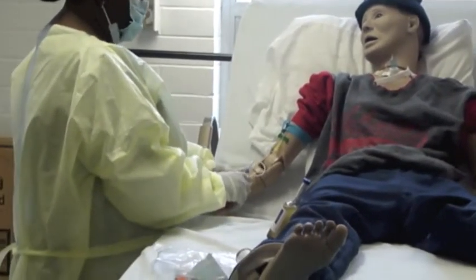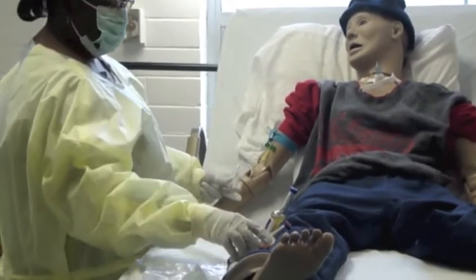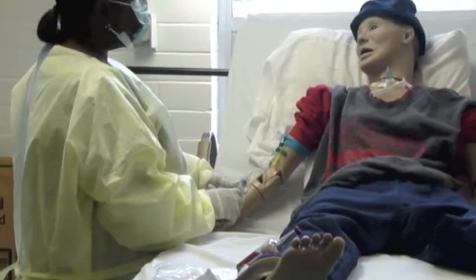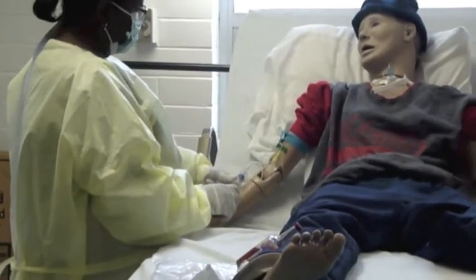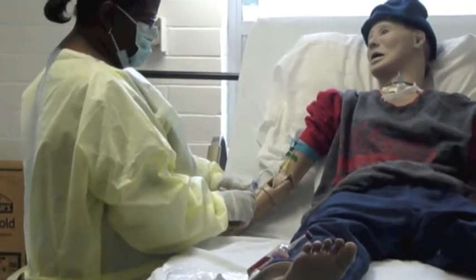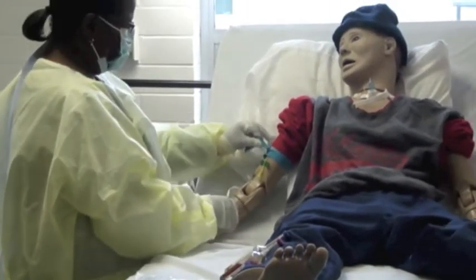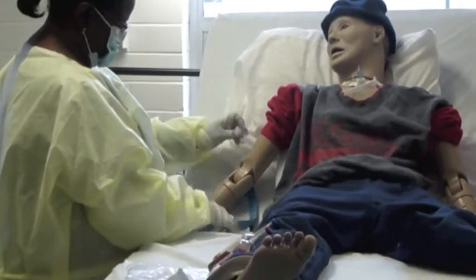Well, don't you have 3 bottles there? Yes, I do. Well, do you have to take that much? No, I don't, sir. I can just put 3 in each bottle, and that would be good enough for us, okay? All right. That's much better for me. Leave my blood. I don't want a transfusion. Yes, sir. Thank you. I'll leave some, okay?